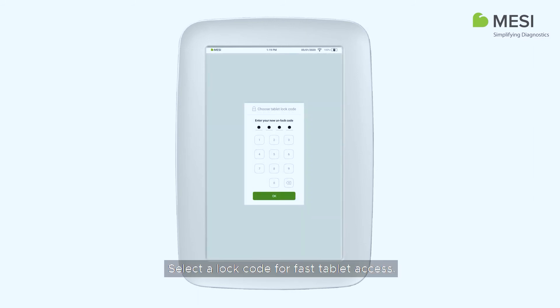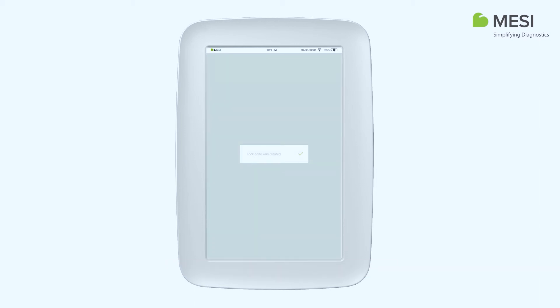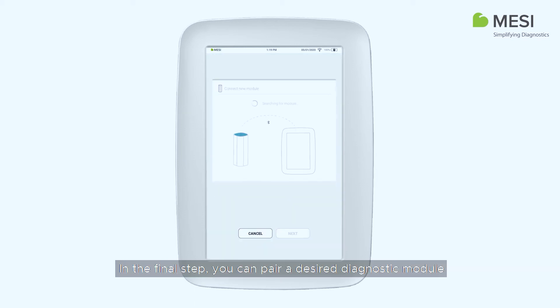Select a lock code for fast tablet access. In the final step, you can pair a desired diagnostic module to your Macy M-Tablet by following the on-screen instructions. This can also be performed at a later time.